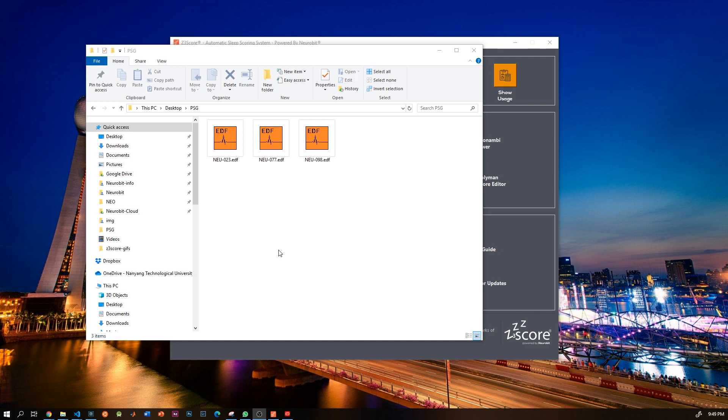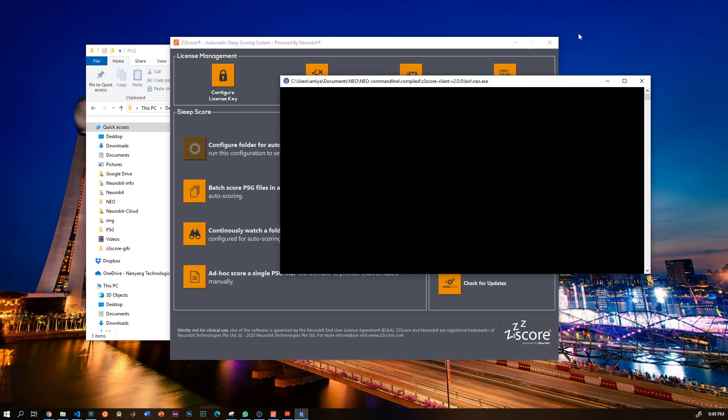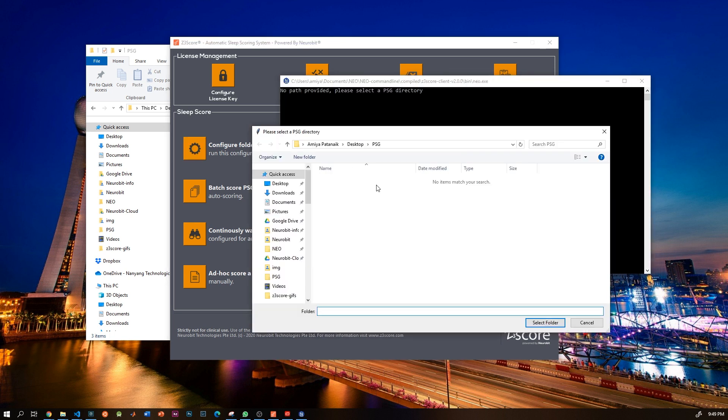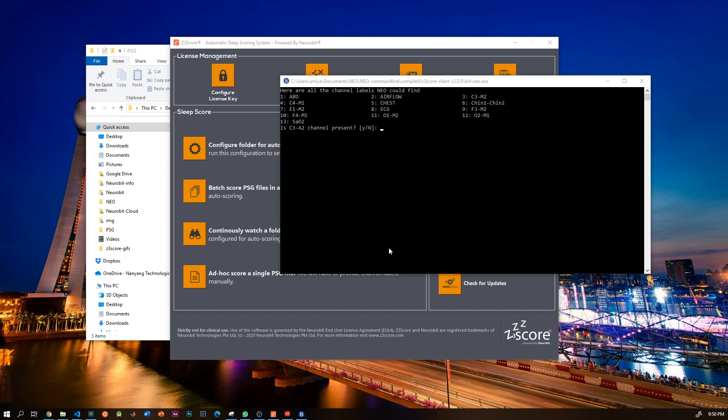Once you do that, let's go to z3score and click configure folder for auto-scoring. A new window will open and ask you to select a folder. As soon as you select the folder, z3score will read the channel labels of all the EDF data in that folder and ask you some questions. So is C3-A2 present? Well, in this case it's yes.